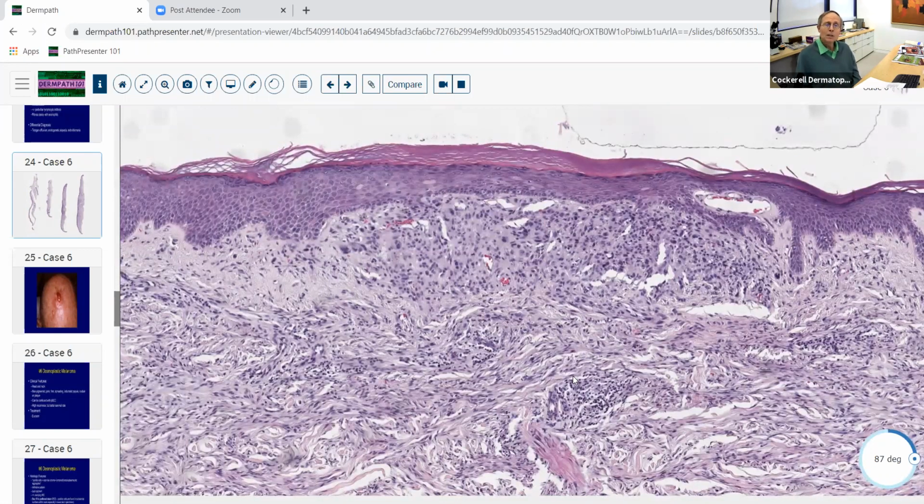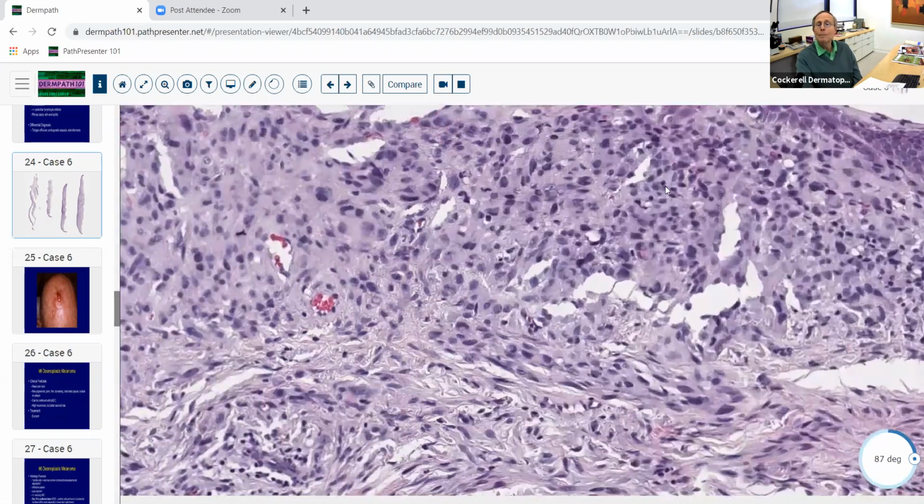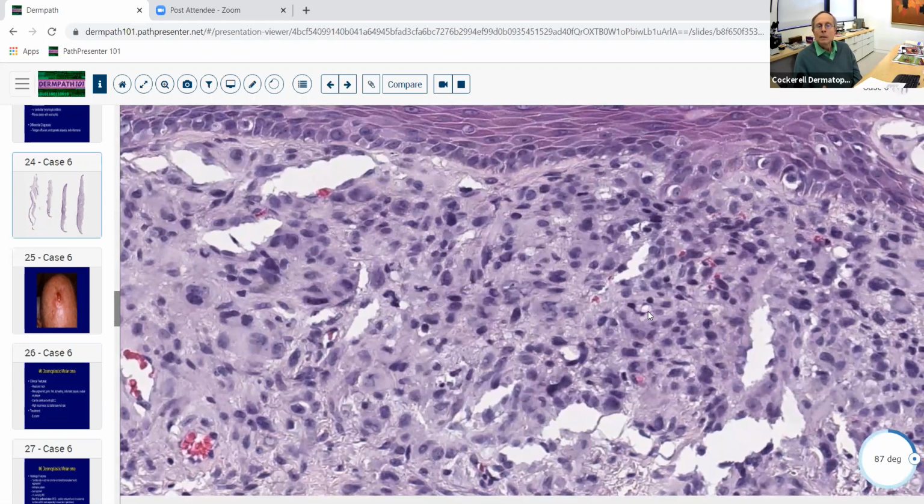So let's ask ourselves, is there anything going on in the epidermis that may be contiguous with the lesion? Up in here, we've got more of an epithelioid area. So we've got spindle in the bottom, more of an epithelioid morphology at the top. And here's a mitotic figure here. So we're dealing now with a malignancy. This is not symmetrical. We've got an epithelioid area here, and we've got spindle areas in another area. That's a sign of asymmetry. Boom. More likely to be malignant than not. We've got atypical cells on cytology. So again, we can't rely on our architectural features here as well.